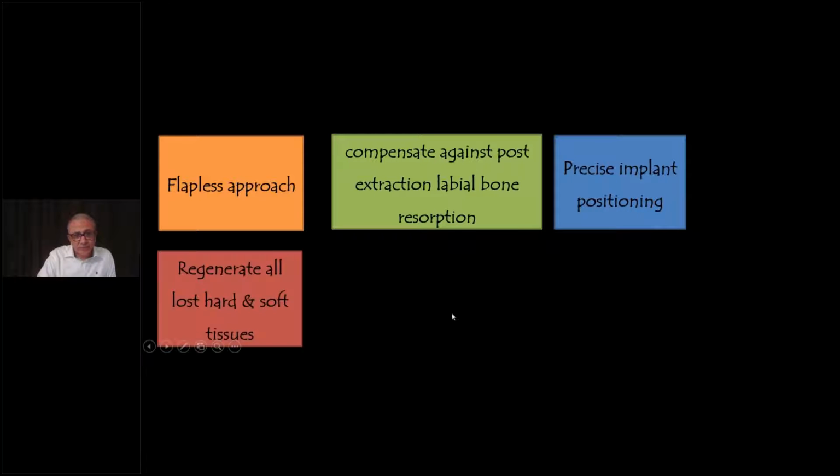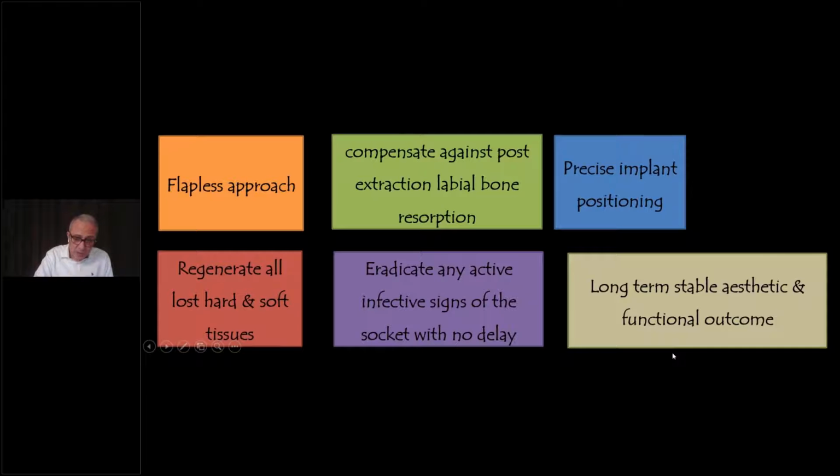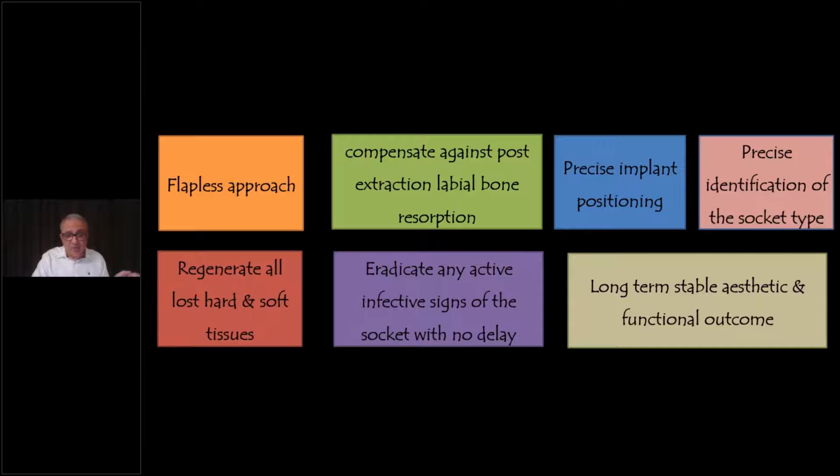Precise implant positioning, not arbitrary anymore. Regenerate all the lost hard and soft tissues. Eradicate any active infection signs of the socket with no delay. That's something that has to do also with a good procedure and long-term stable aesthetic outcome. That's something that I have to really emphasize: I can't really judge a case on a 6-month basis. I can't just judge an outcome on the short-term outcomes, 6 months, 1 year. No, we have to get 1 year and up. That's what you should measure your cases with, especially with immediate implant placement.